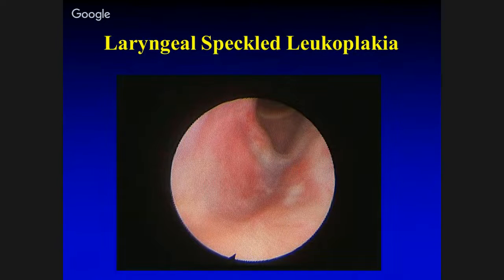It's erythroleukoplakia. So clinically, the more worrisome lesion is anything that's red, for significant underlying dysplasia. But leukoplakic lesions can be dysplastic too. So we as pathologists should not use the diagnostic term leukoplakia in our pathologic diagnosis. That's a clinical determinant. The correlate is keratosis or hyperkeratosis.